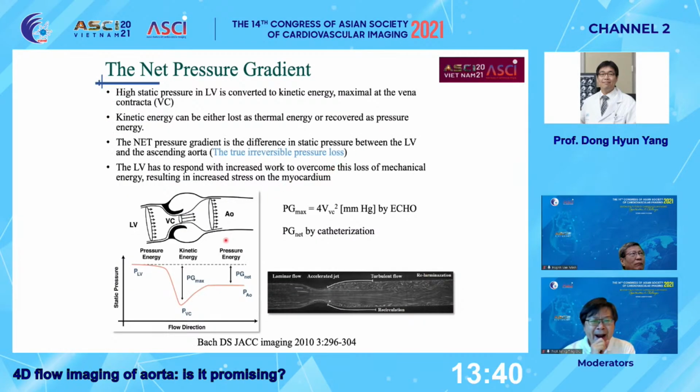For estimation of pressure loss across the stenosis, the flow velocity measured at the vena contracta is frequently applied on echocardiography. But the limitation of this method is the very well-known pressure recovery phenomenon, particularly in more complex stenosis shapes such as prosthetic valve failure.